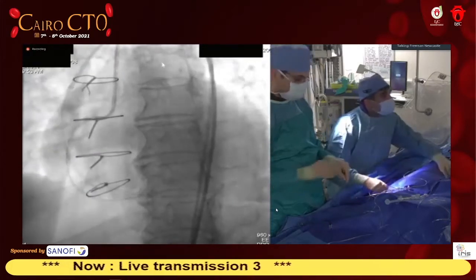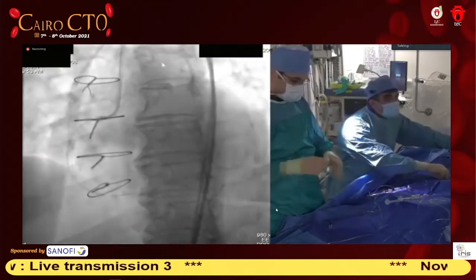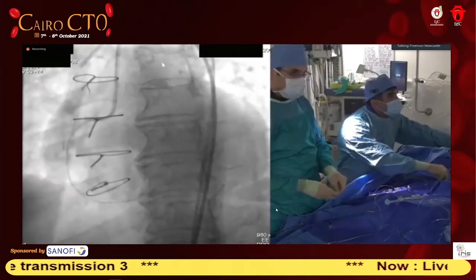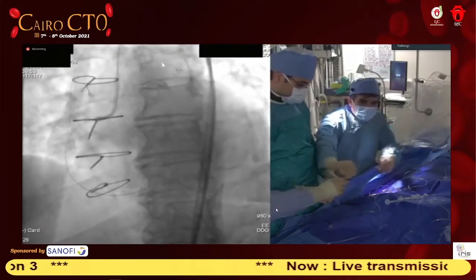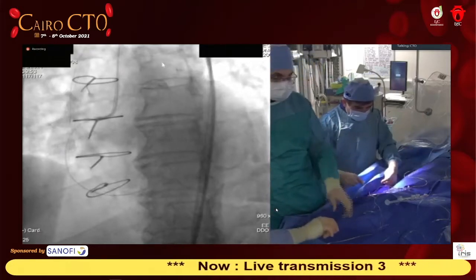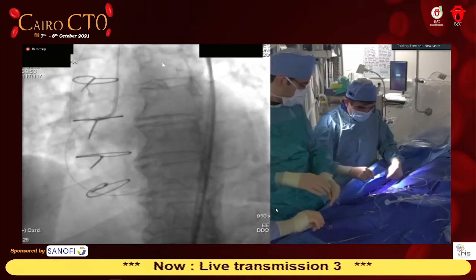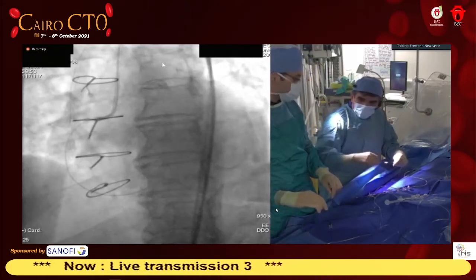Okay. Because it's a vein graft. Can I have some atropine, please? Okay. I'll have a Fielder FC. The heart rate is slow. You have some bradycardia. So I'm going to just put the wire down and then move that microcatheter so the blood is flowing.